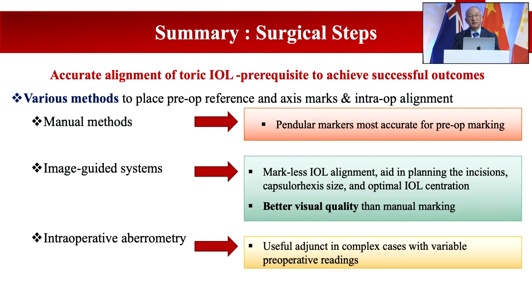The only thing is you need to have an inventory of lenses with you, 2 or 3, so that you have accurate lenses in these cases also. That is how you're going to achieve good results from these patients.